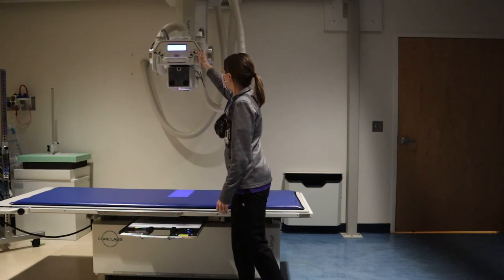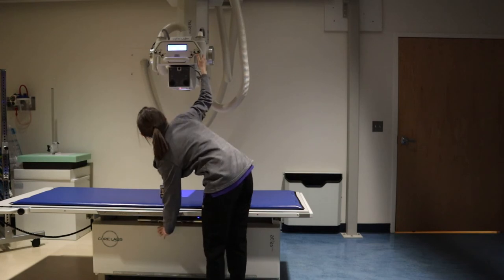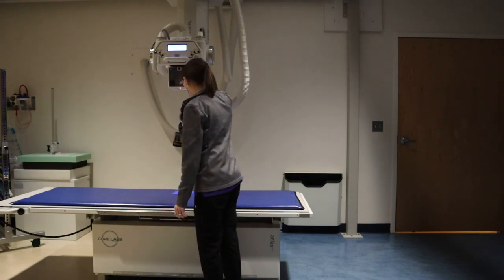Here I'm setting up for an abdomen, also known as a KUB. It stands for kidneys, ureters, bladder. And that's pretty simple as well.